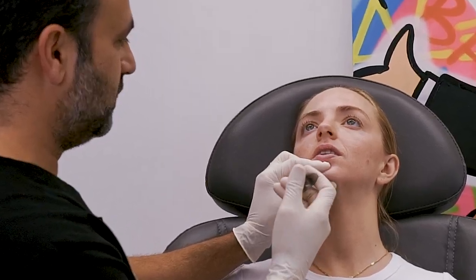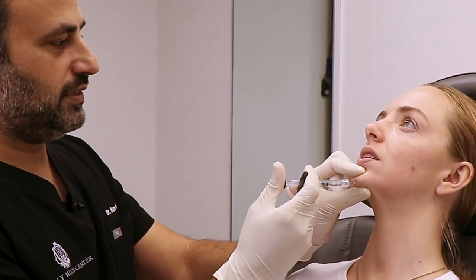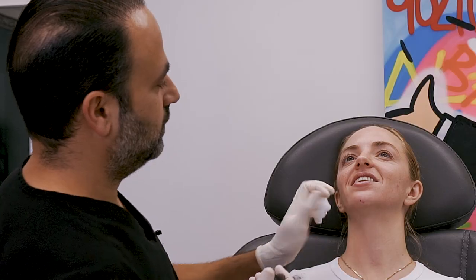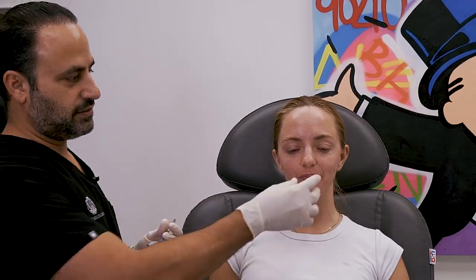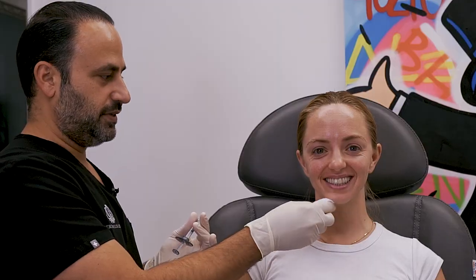We want it very refined and firm looking — the chin is supposed to be firm. She already has full correction on the front of the chin. We're balancing it to her forehead: when you look at her from the side, her teeth are slightly prominent and push forward. We're making the chin match now so the teeth don't look so prominent. Now if you look at her chin and her forehead, it looks like a nice even arc. If you put too much soft tissue, when she smiles it would end up coming down, and 3-4 months later it would start getting doughy.